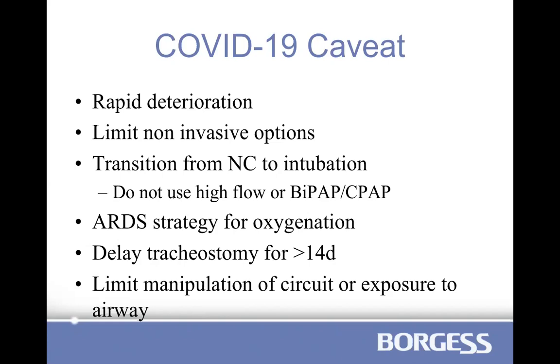I don't do them on prone patients with high PEEP requirements. So you have to already be getting better and be showing me that you're getting better before I would consider traching this patient. And again, limit the manipulation of the circuit, and opening up the circuit to the greater world, because it is aerosolizing virus.